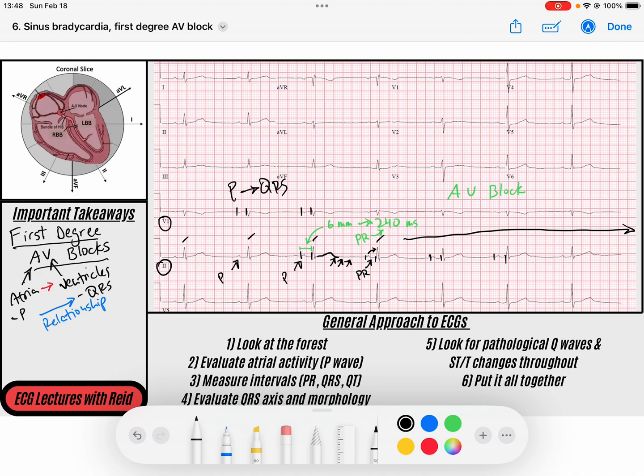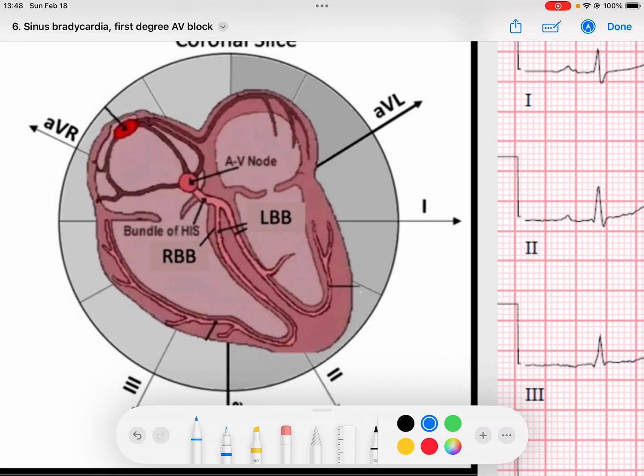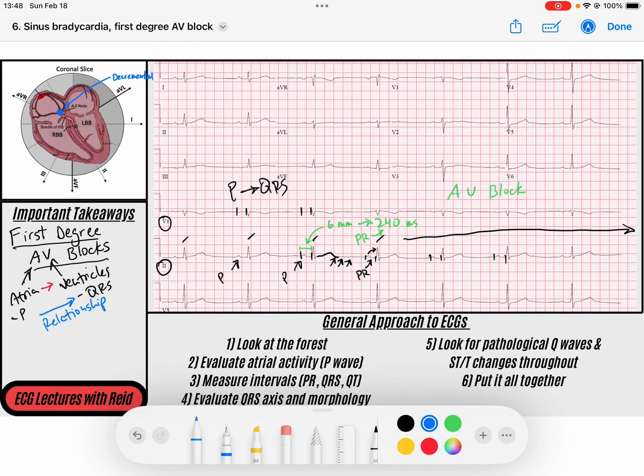And every single P conducts to a QRS. And based on our anatomy beforehand, we know that the AV node itself is where we can see the slowing of that conduction. So the AV node itself, not the His bundle, is delaying that signal for too long. So we're seeing evidence of that decremental behavior, decremental conduction, earlier in terms of rate than we should. Usually that only occurs when we get to really fast rates, but we're seeing it at normal rates here.